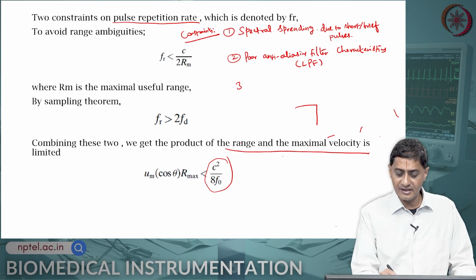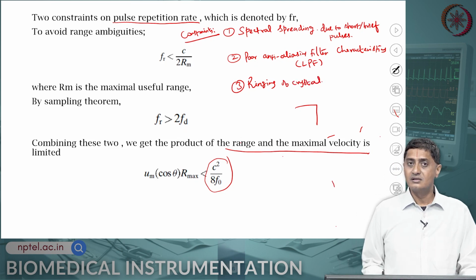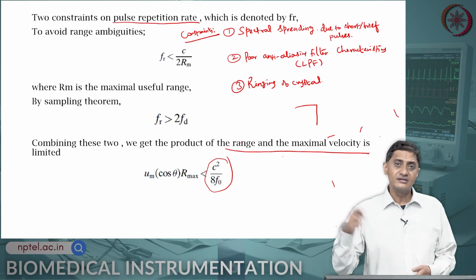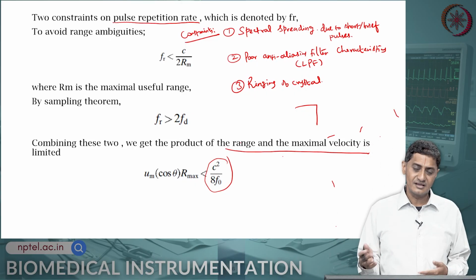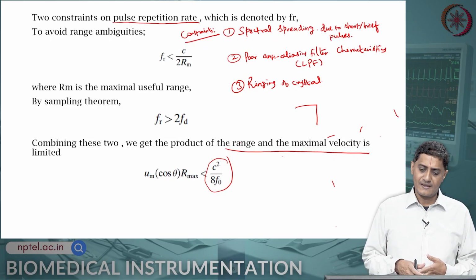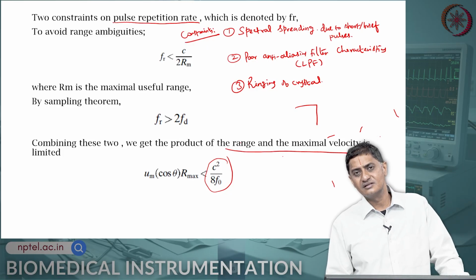So, there will be ringing that happens in the crystal at its resonant frequency. This leads to a situation in which, although the electrical circuit is turned off, the sound is still getting generated. This is because the Q factor for these oscillators is relatively high.